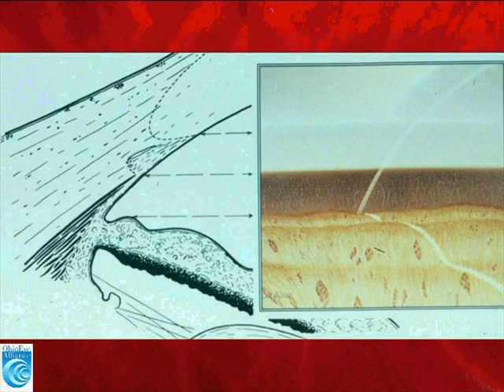In this case, the ciliary band is broad and dark brown in pigmentation, fairly uniform. We should be aware of pathologic conditions such as angle recession, and it's often important to compare one eye to the other eye, especially after a trauma, in order to determine whether or not an angle recession has occurred. This will be covered in a little more detail in the pathologic section of gonioscopy.